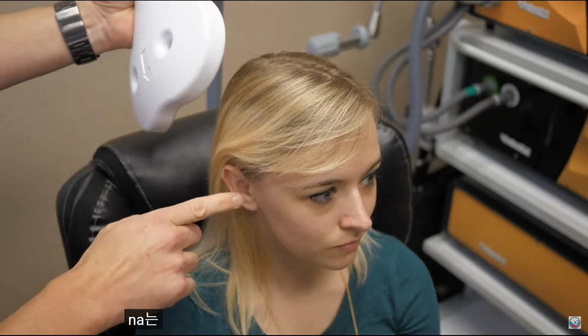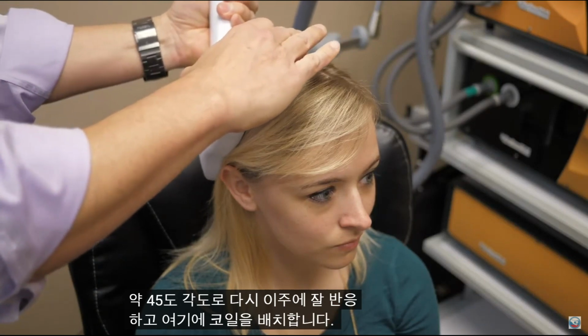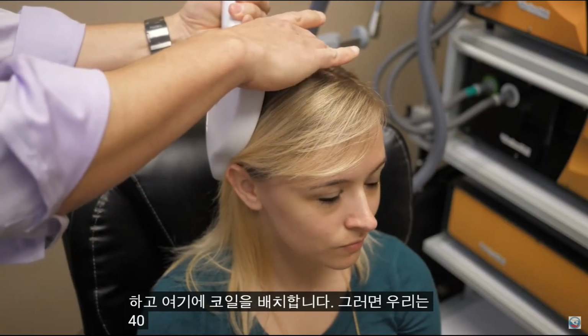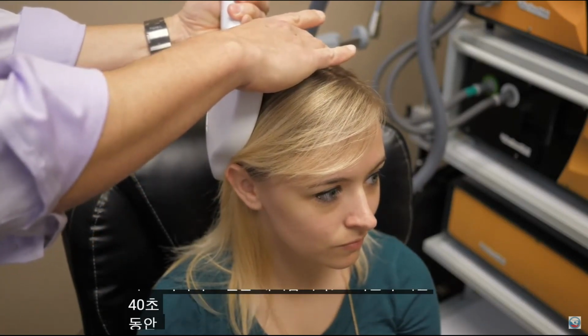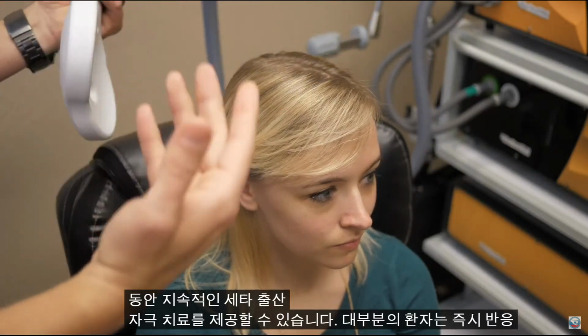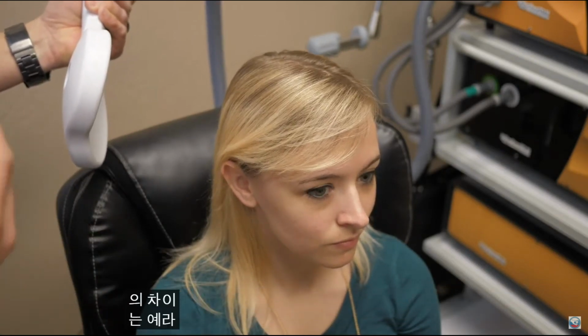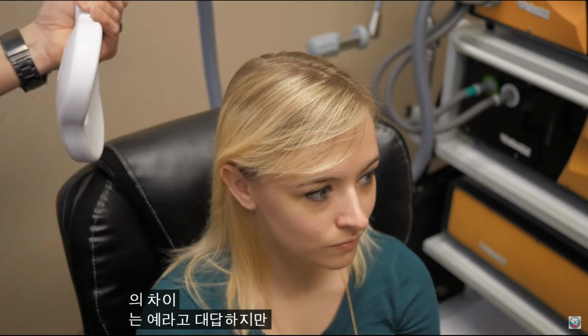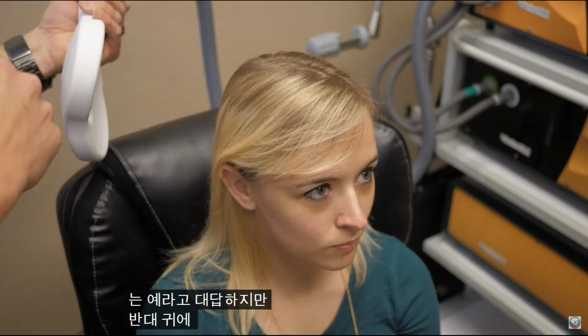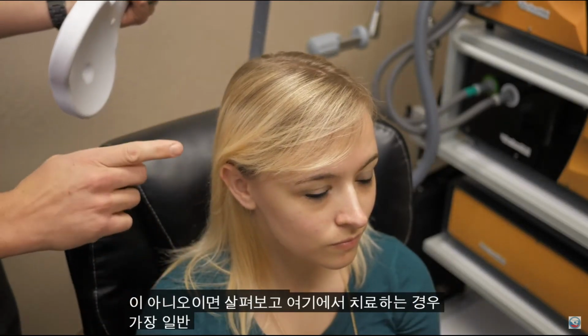So again, tragus, about a 45-degree angle, and we'll place the coil here, and we can deliver then a treatment for 40 seconds of continuous theta burst stimulation. And for most patients, they'll respond right away. So we can then ask, do you notice a difference? Most patients say yes, but just in the opposite ear. And so then if the answer is no, then we'll then take a look and trial a few other places.